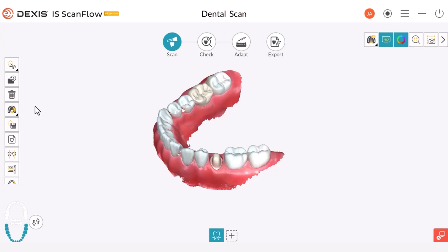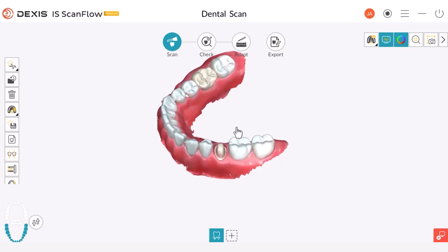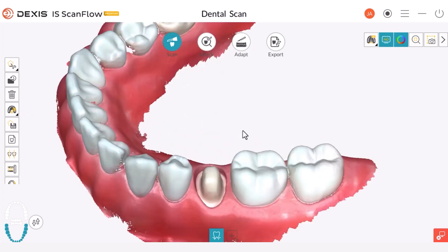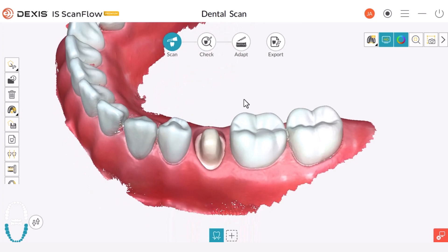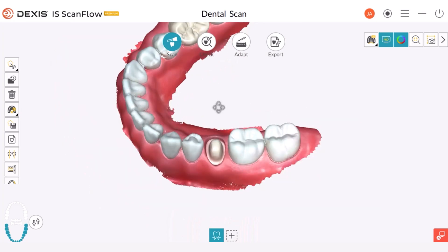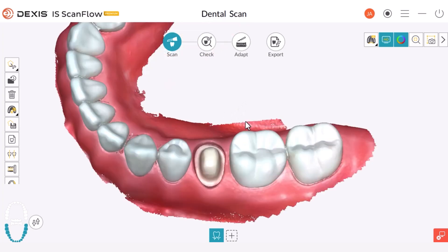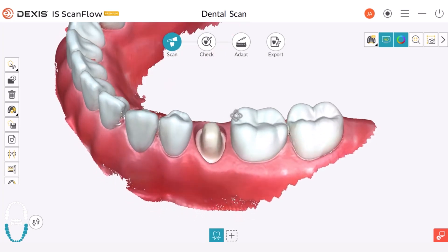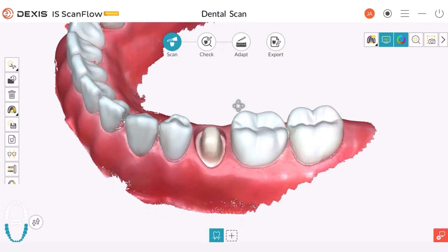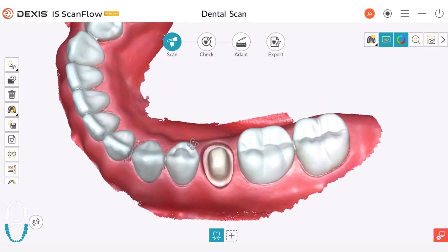Let's begin by exploring the lock tool. Imagine that you are scanning a prep tooth like this one here. Sometimes it's challenging to maintain a clear view of your prep because it is subgingival, or you are struggling with tissue management, saliva, or blood.